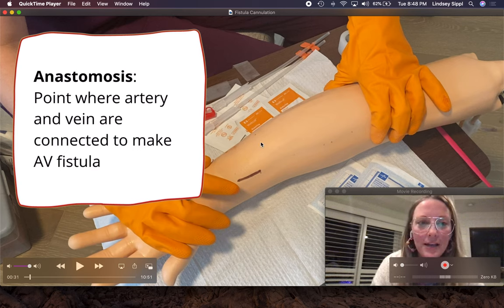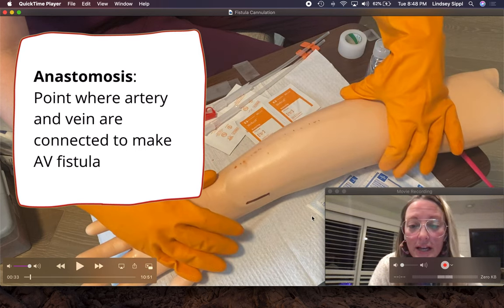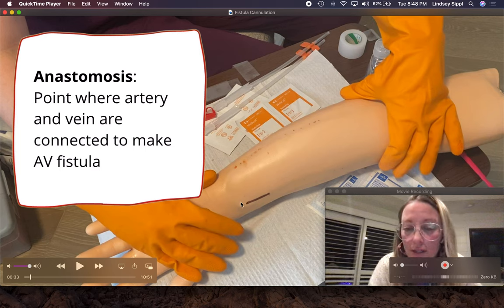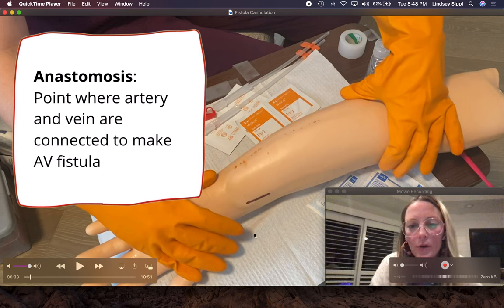This next thing I'm showing you is the anastomosis. This is where the surgeon connected the artery and vein to make the fistula. This is where the increased blood flow goes that gets that vein nice and fat for our needles. I'm going to stay at least two inches away from the anastomosis. If I go too close, I might get a great flash of blood, but once I hook them up to the machine, I am going to get high arterial alarms because the blood flow near the anastomosis is just not where it needs to be and you will not get the blood you need to clean.